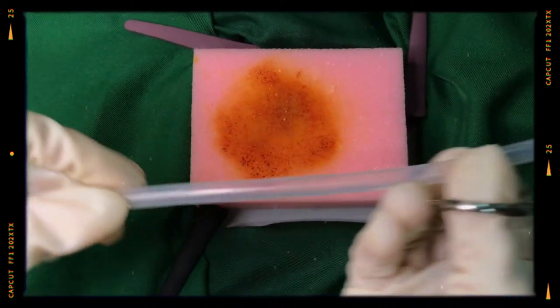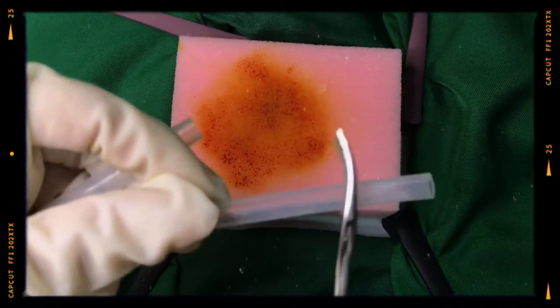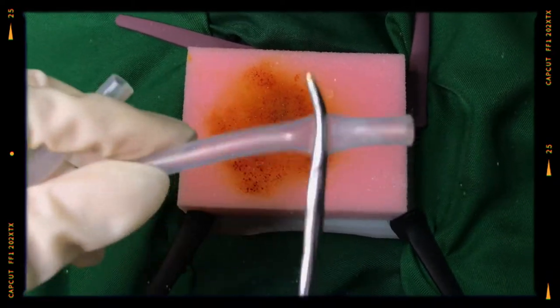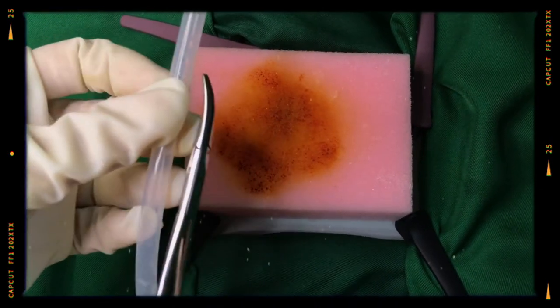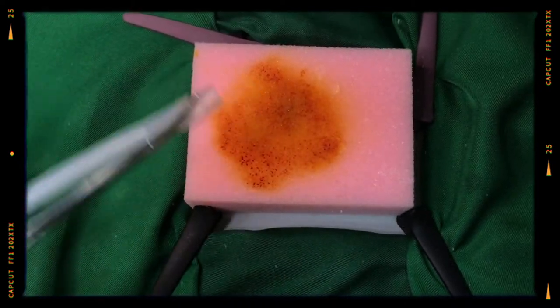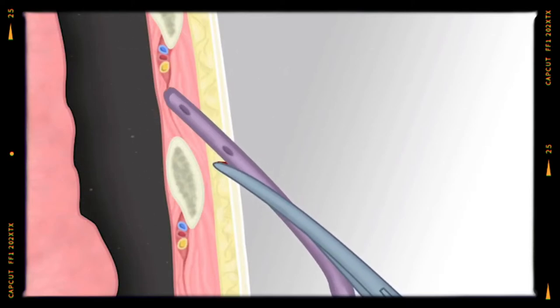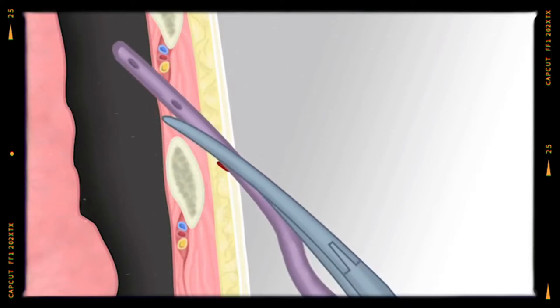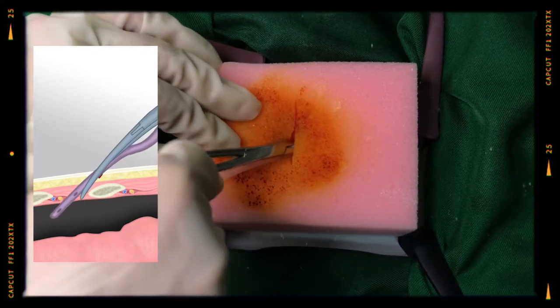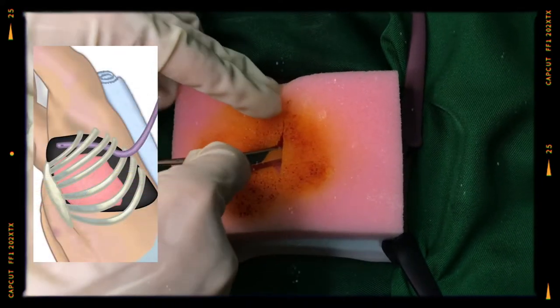Select the tube to be used. If hemothorax is suspected, it is advisable to clamp the distal end of the tube to avoid making a mess. Grasp the tip of the tube with a long kelly clamp so that the long axis of the clamp is almost parallel to the long axis of the tube. Then insert the tube into the chest using the large kelly clamp as a guide. Remove the large kelly clamp as soon as the tube reaches the desired position in the chest.